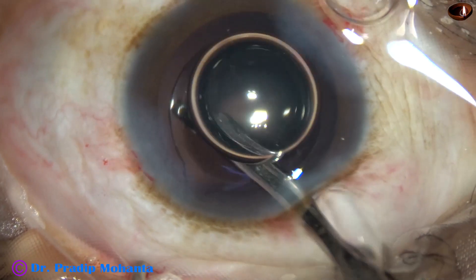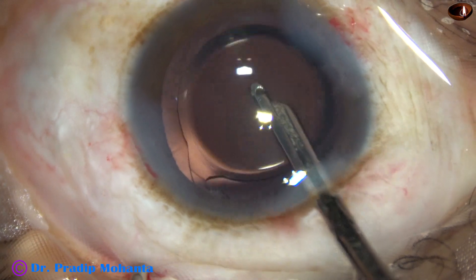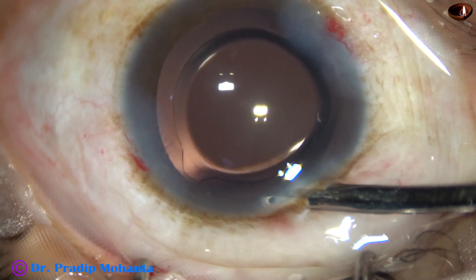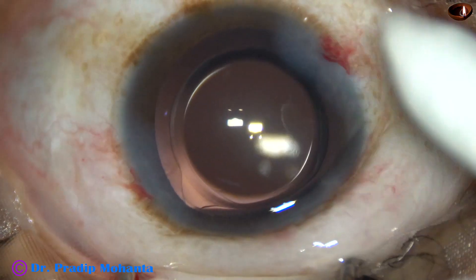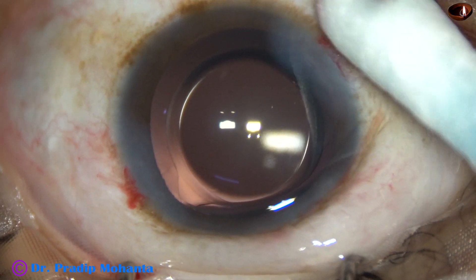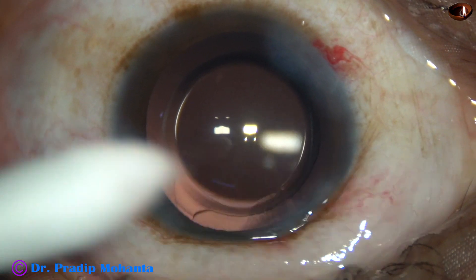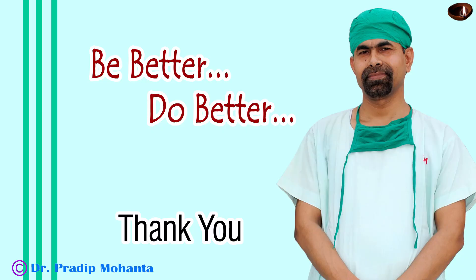And now this is the final lavage of the anterior chamber. An air bubble was injected because the anterior chamber was becoming shallow, to buy some time. The anterior chamber is nicely formed and the integrity of the wounds is checked. Viscoelastic is applied and moxifloxacin is applied over the cornea, and the case is concluded. Thank you very much for your attention. Hope this video will help you in developing your surgical skills.